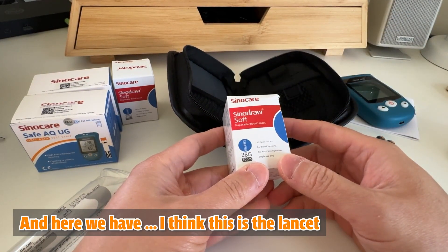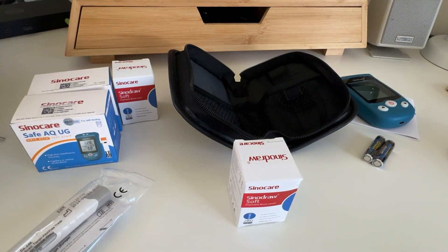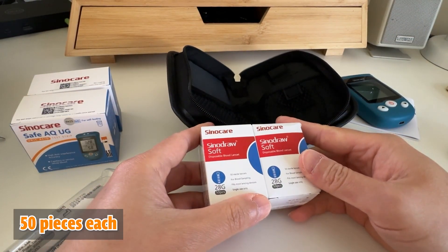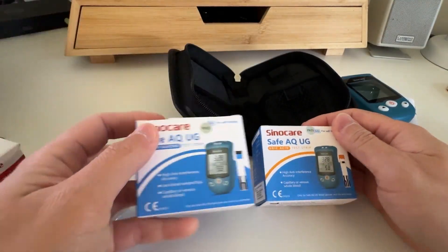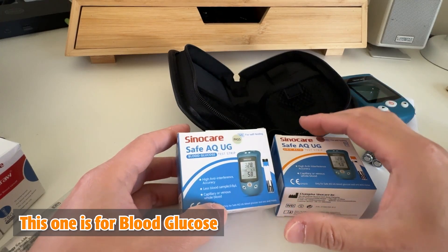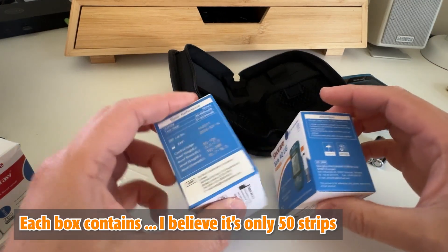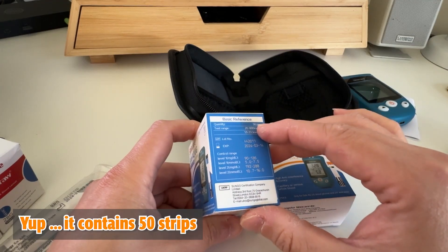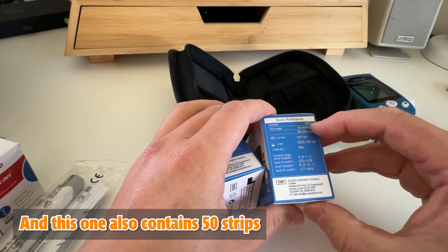I think this is the lancet. There are two boxes of lancets, 50 pieces each, and the testing strips — this one is for uric acid and this one is for blood glucose. Each box contains 50 strips.